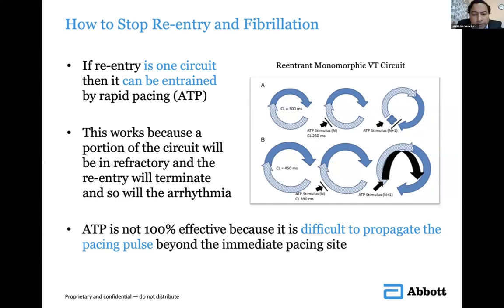I would like to add one thing in this. This is one function which is available in ICDs and CRT-Ds. Pacemakers usually, when you talk of the word ATP, somehow have less of it. But yes, when you are looking at a monomorphic VT circuit, your devices give you those pacing trains with that morphology, and the device does it for you. But again, you can also do it in refractory VTs.